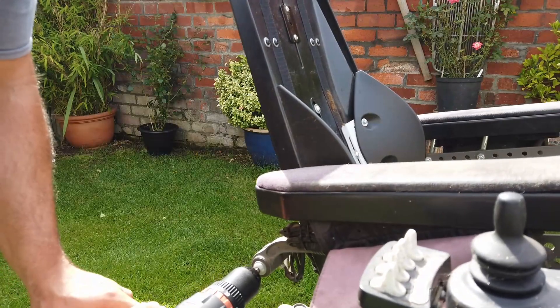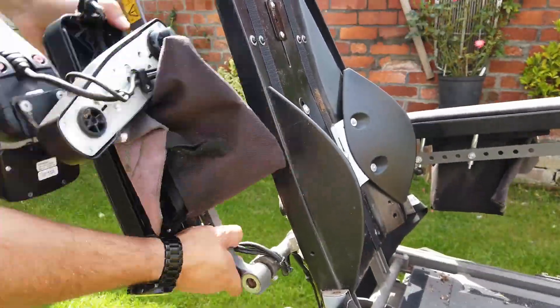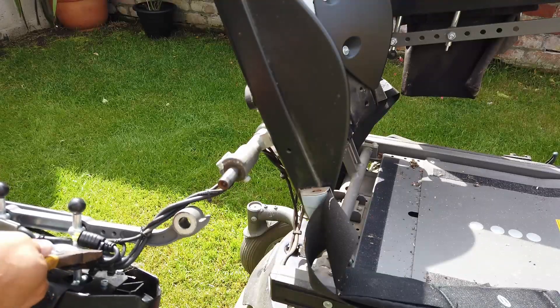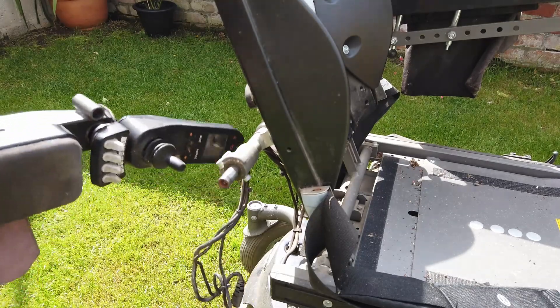This Permobil wheelchair costs between seven and twelve thousand pounds new depending on specification, so you can imagine the amount of engineering that's gone into it. It's really really well made, absolutely solid, and because of that it's really quite hard work to pull apart.